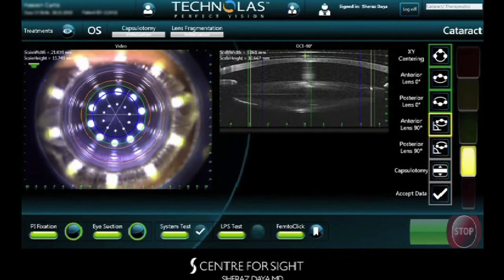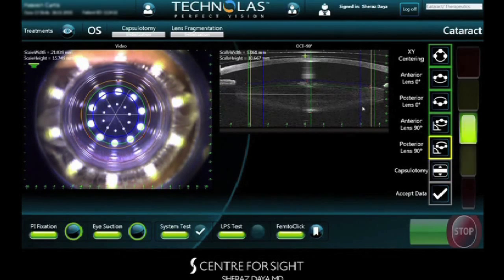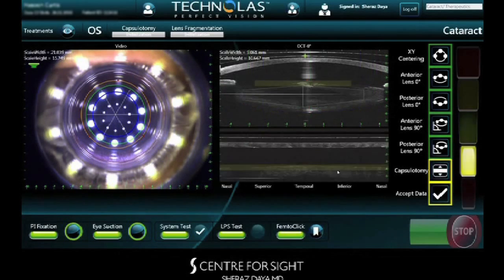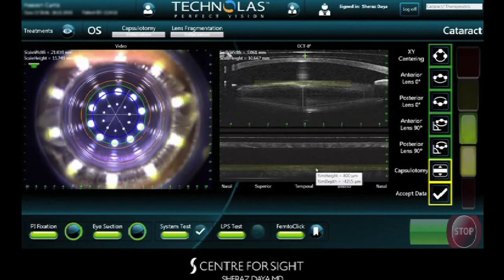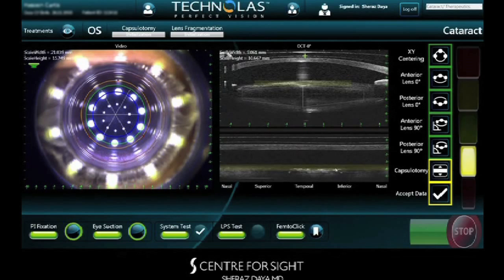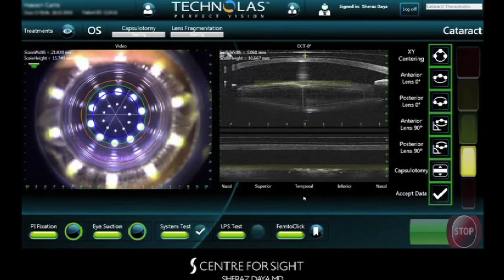Once accomplished, another OCT image — the ring OCT — is used to identify the level of the anterior capsule by unfolding this 360 degrees. The green band identifies the width of the laser cleavage, ensuring the capsule is resected 360 degrees with no tags or bands. Once this is confirmed, laser ablation commences with the capsulotomy.